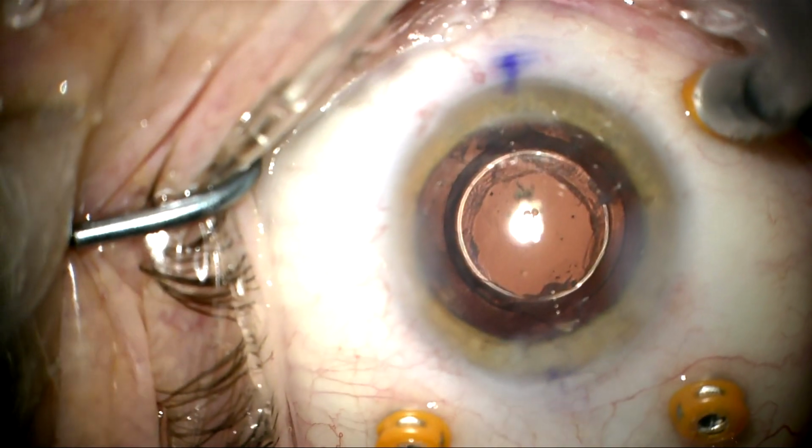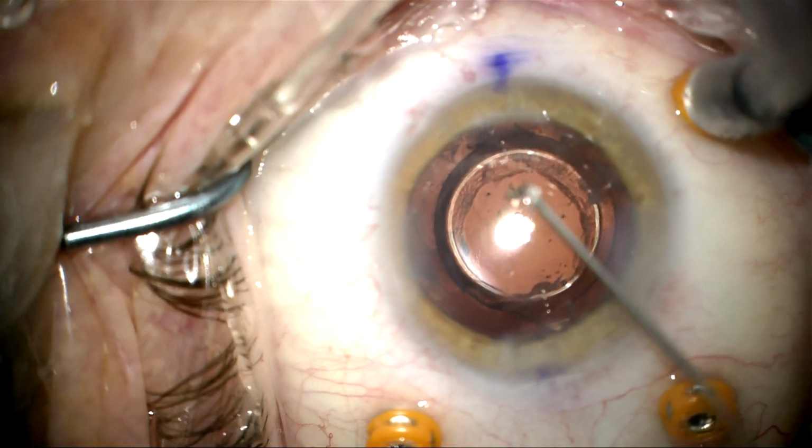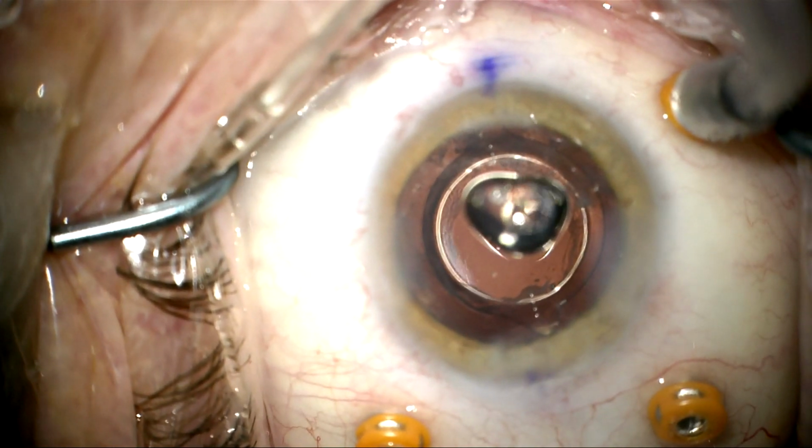And now we're going to go ahead and complete the pars plana vitrectomy using posterior visualization to remove all of the vitreous floaters and any of the lens material that's fallen posteriorly during the manipulations. And here you can see that the vitreous is quite turbid and cloudy, and this is something that was bothering him. He was aware of this. So here we're going to clean all this up.